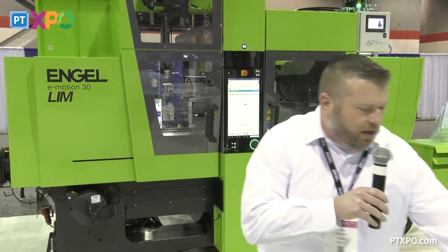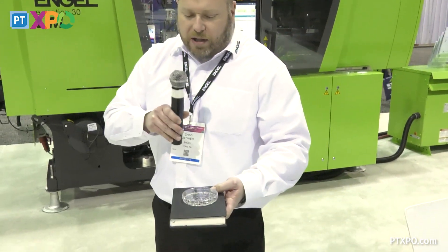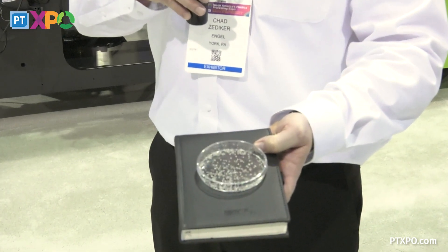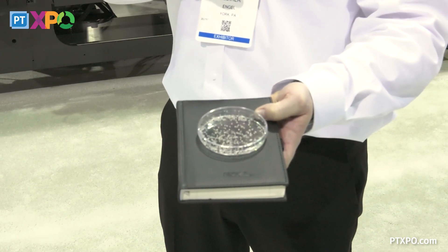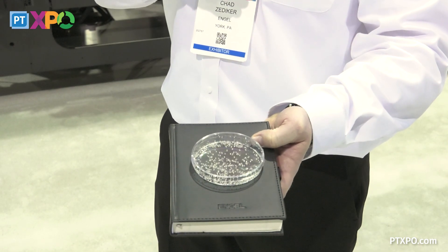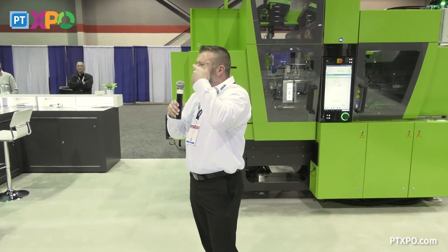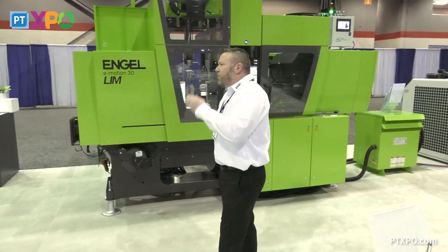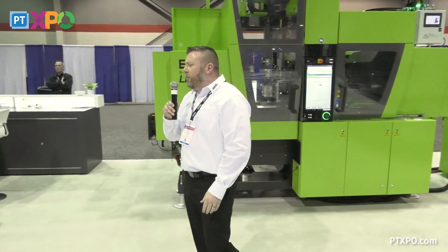As you can see here, today the part we're making is a micro LSR tear duct plug. This mold is a 32-cavity mold. These parts are used in eye surgery for LASIK — they place it in your tear duct so that there are no tears being produced while they're using the lasers and working on the eye.